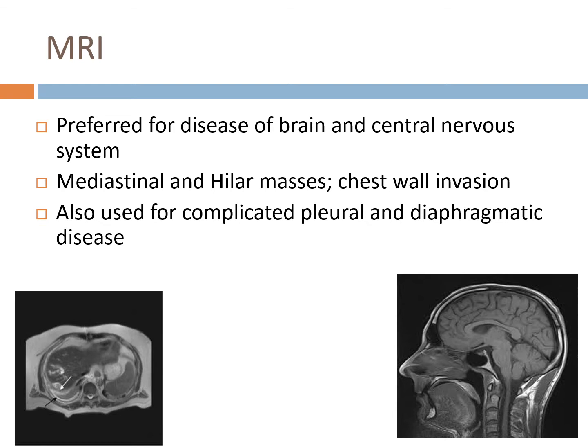The big deal with taking patients into CT or MRI is that once they get down there, we have to switch all their leads on their chest. They have to change the pump over for their IVs. They have to put everything onto MRI compatible devices. We have a ventilator that's MRI compatible, all that kind of stuff. So it's quite the process to get them all switched over, and then you have your MRI person from radiology down there, and they're very knowledgeable and they definitely help.